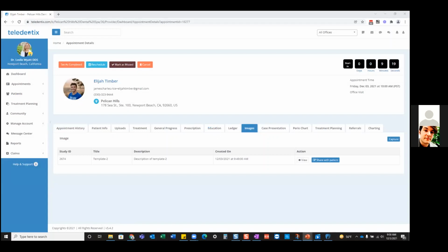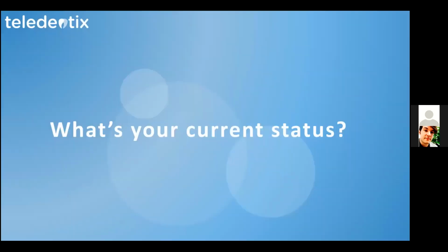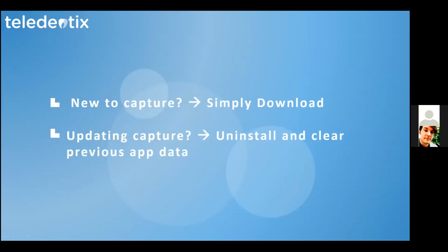Let me go ahead and share my other screen to kind of go back into the presentation here to talk a little bit about what your current status is. And what I mean by that is, where are you right now with Teledentix Capture? Do you have it installed in your computer right now? Are you having trouble with it? Maybe you've never downloaded Teledentix Capture and you're unsure on how to go about that. So we're going to go ahead and review that momentarily here.